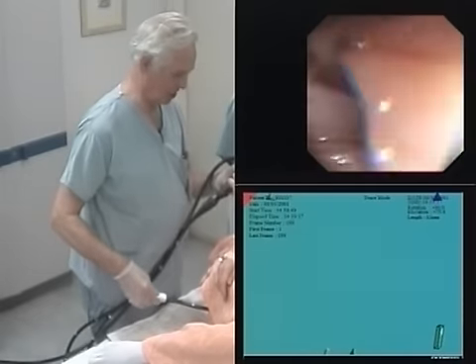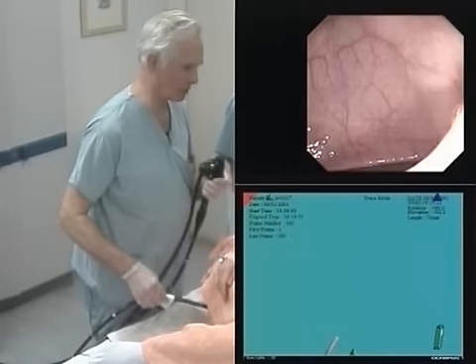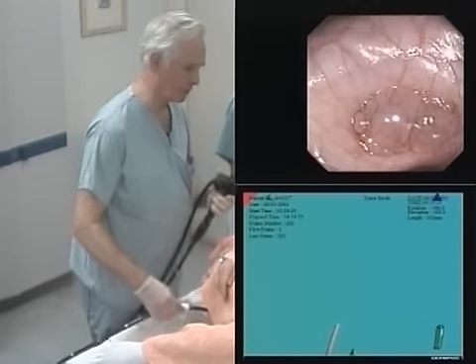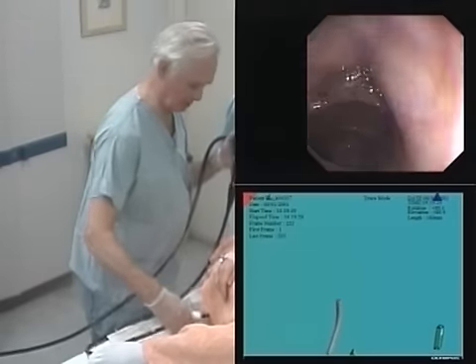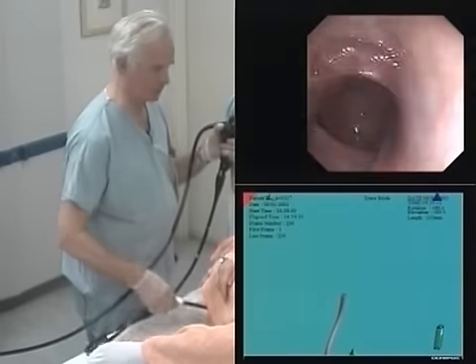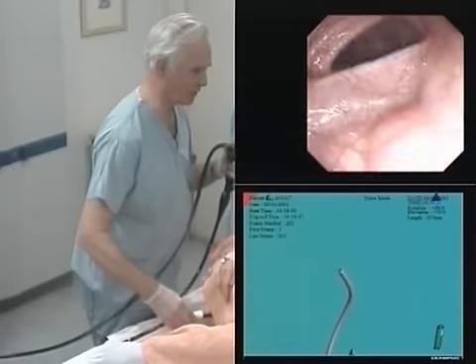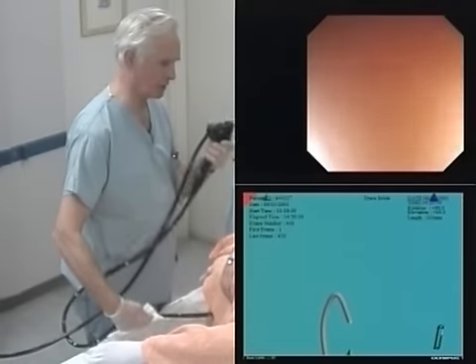Now this is the floppiest, gentlest tube that there is and we hope to surprise you. We'll get a little stretch feeling now as we go in around this bend. Looking wonderful. We're going in very fast. Get that first loop out so far as I can.